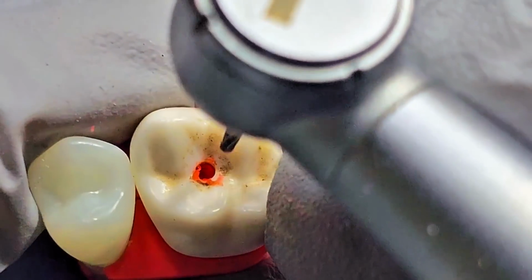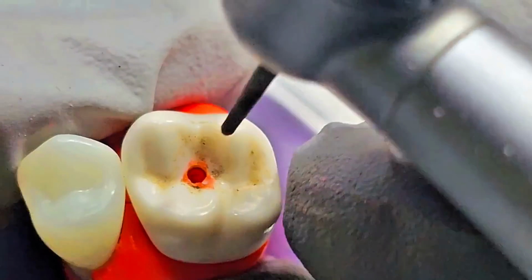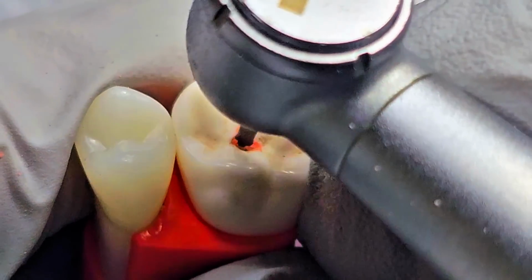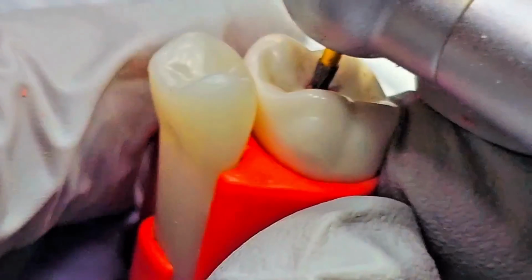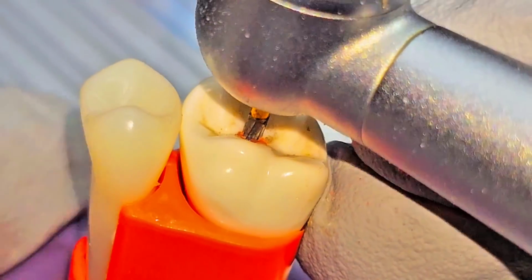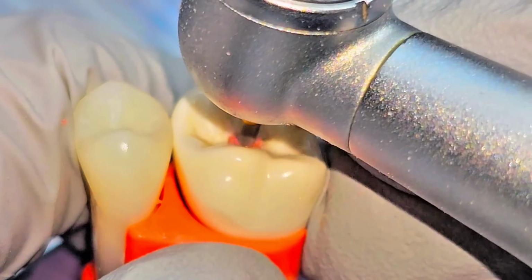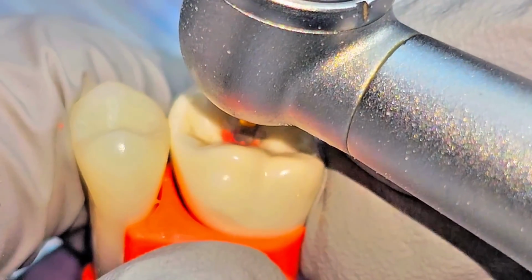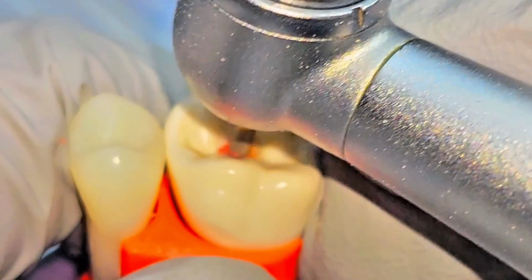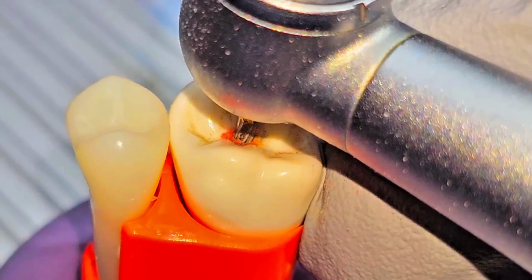And now I'm going to slowly extend, because I still have a lot of room. I can extend the buccal, lingual, distal. At the full depth, I'm going to work. Now I'm going to turn on the light. I'm going to refocus.